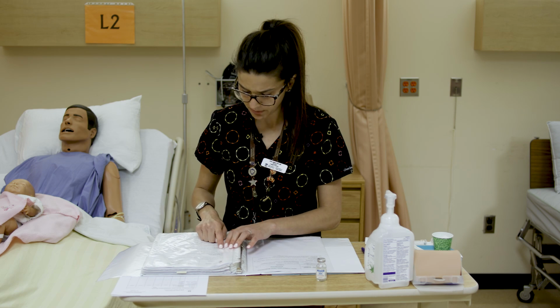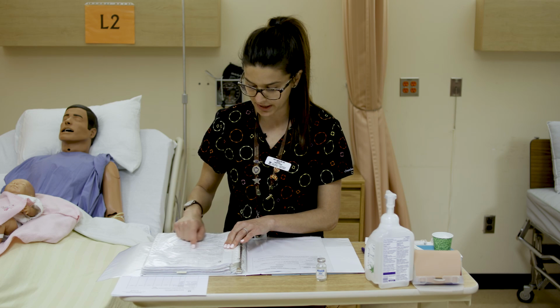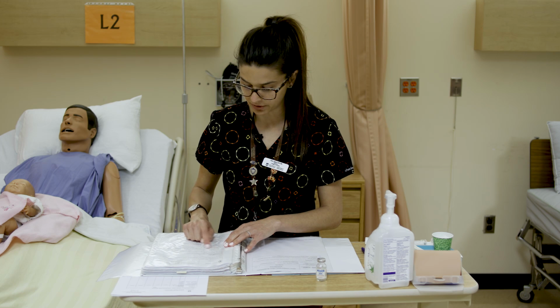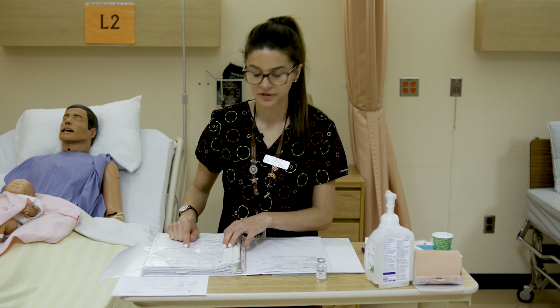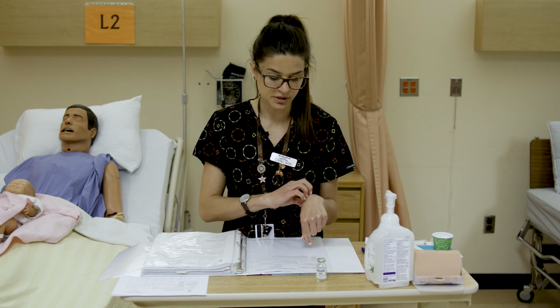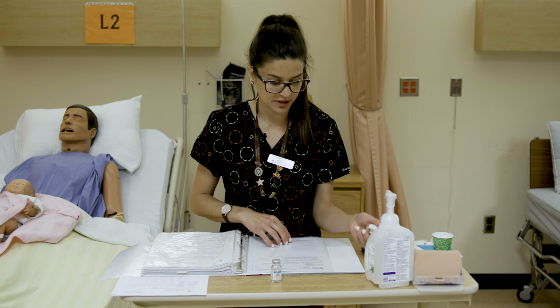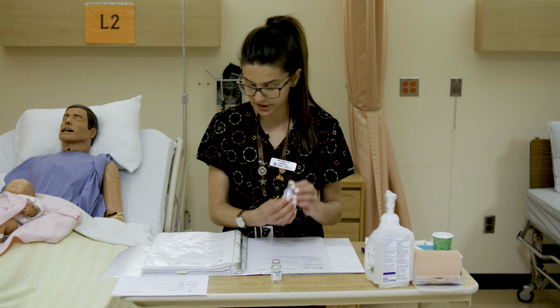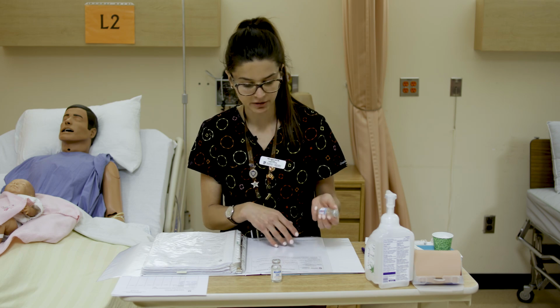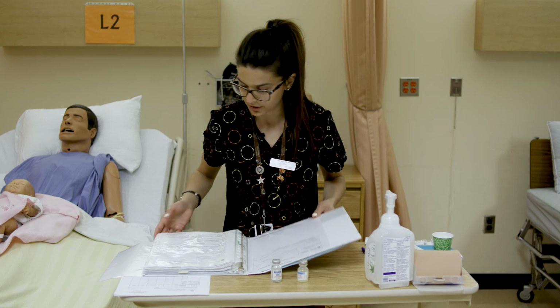So if we keep reading, IM is an approved route for this medication. So it says IM, and then it tells us again what to do, that we're going to need to reconstitute this 1 gram vial with 3.5 mLs of sterile water for injection, and that will have that same 250 milligrams per mL concentration once we're done. So we will put aside our ampicillin and we'll make sure that we have sterile water for injection available to us, which we do. And similarly, we just need to make sure that it's not expired or contaminated in any way. So this is the sterile water we're going to use for injection.